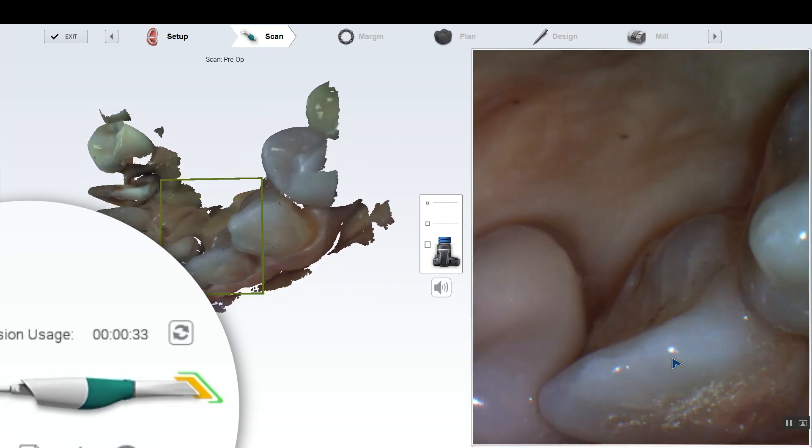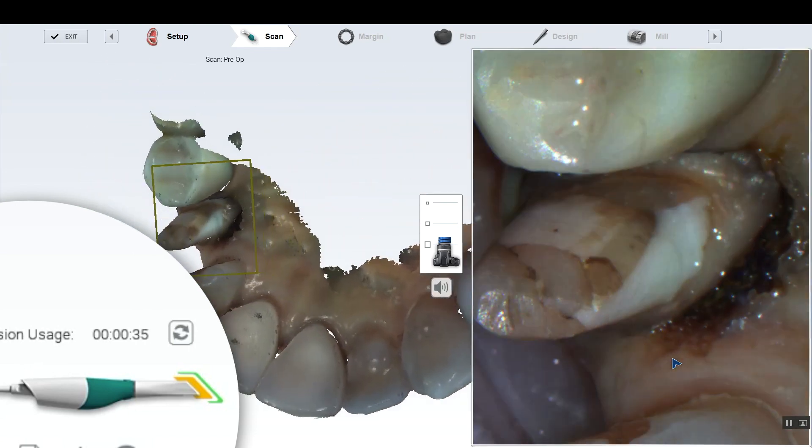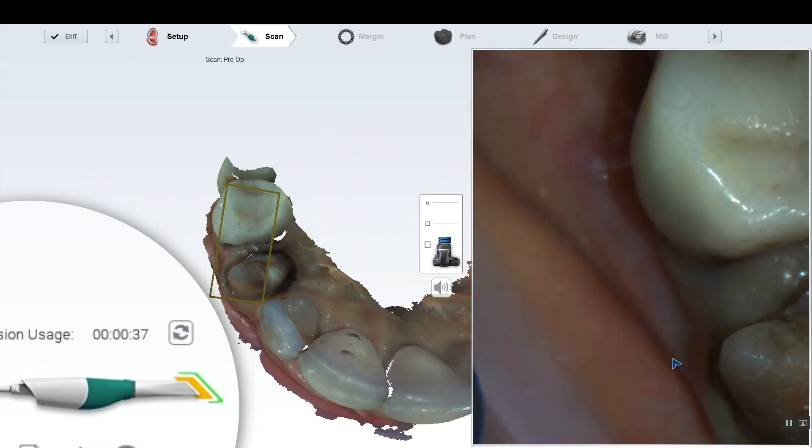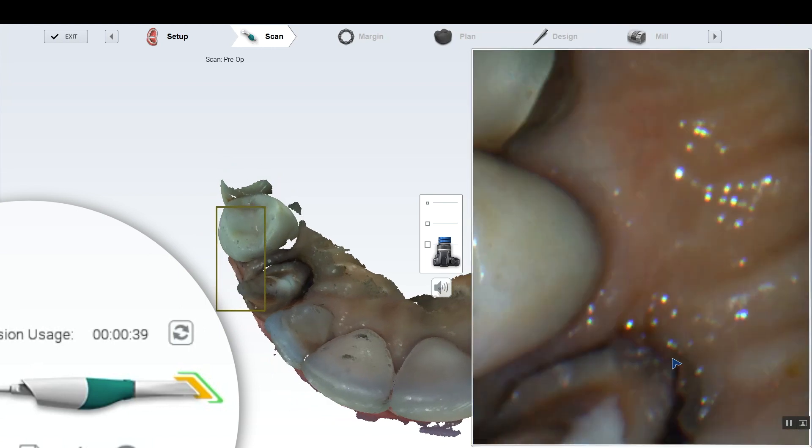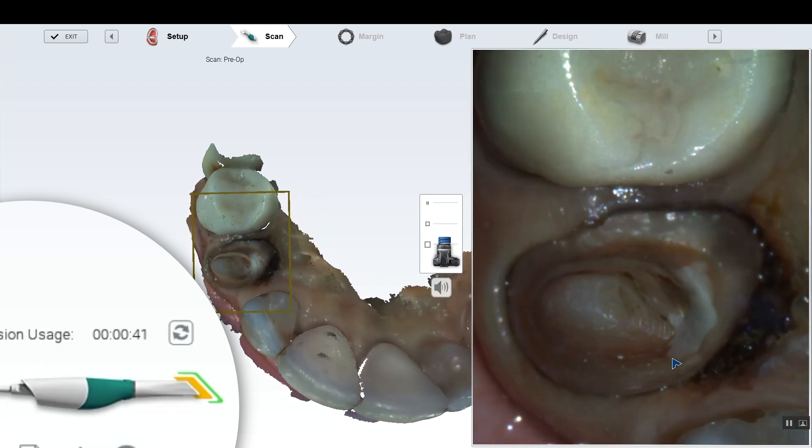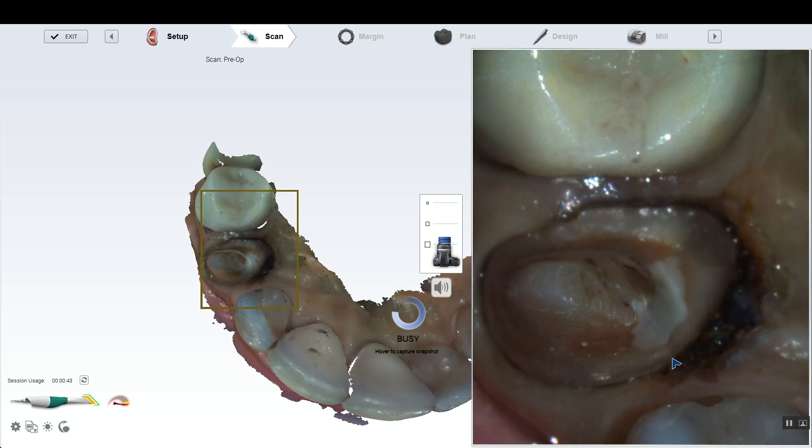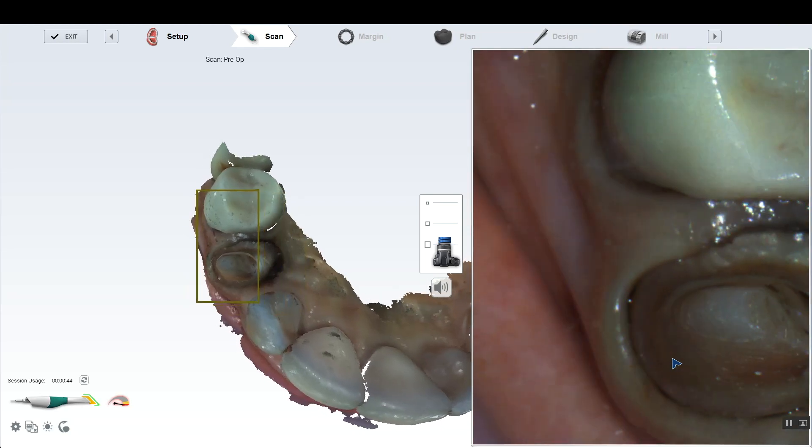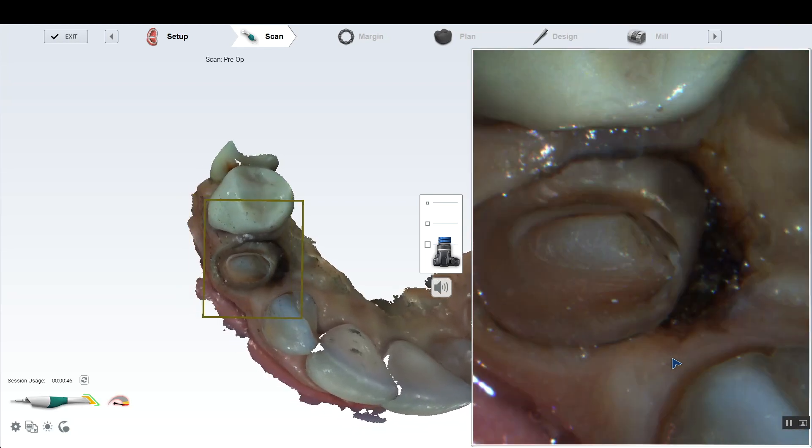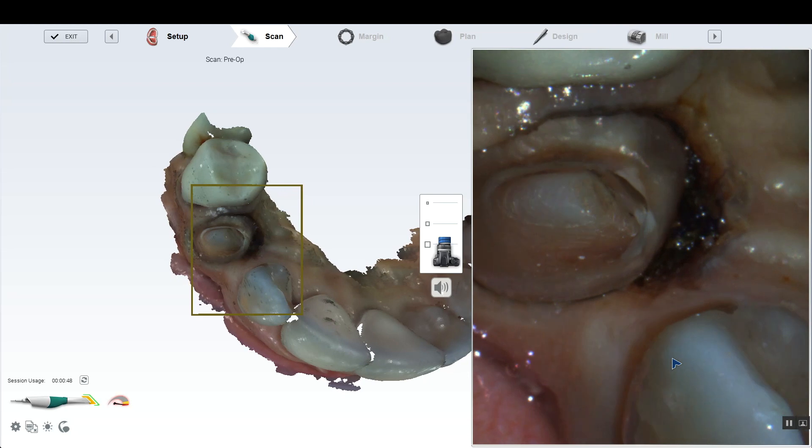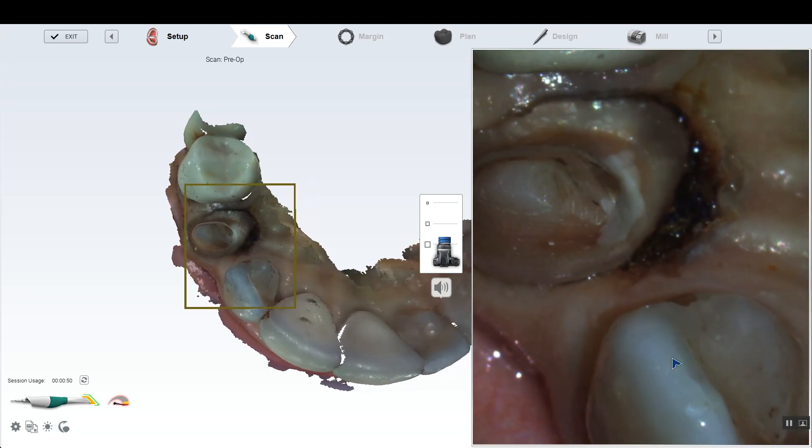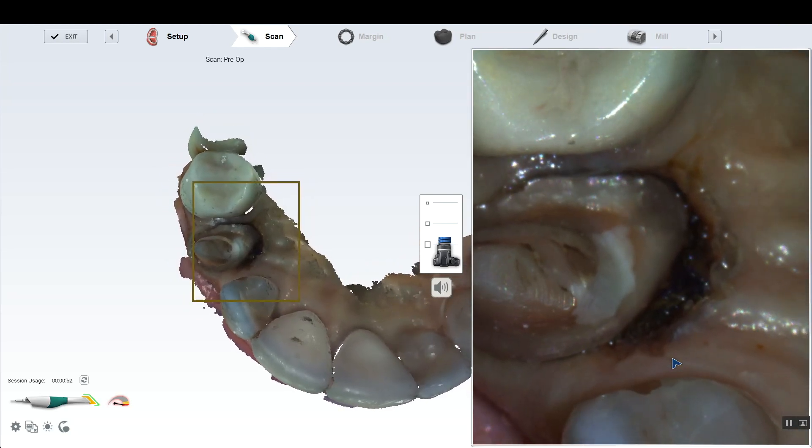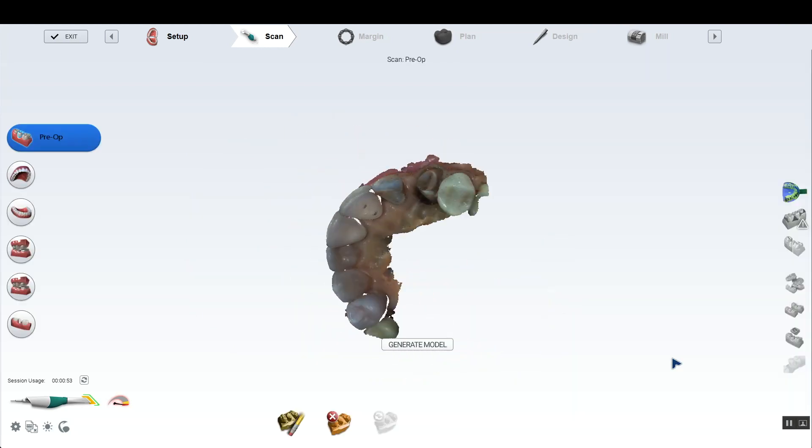I think the lingual finish line is 3 millimeters or so subgingival. And I don't know the rationale of getting that low with the students. I think it was possibly trying to maintain a ferrule around this tiny little buildup. But nevertheless, this is kind of what we're up against here with this over-prepared lingual margin that is also 2 sub-g. So let's go ahead and just render this really quick.